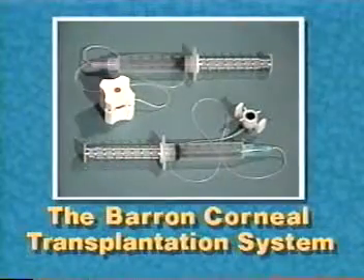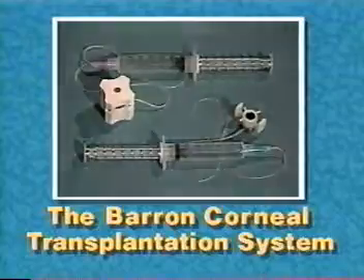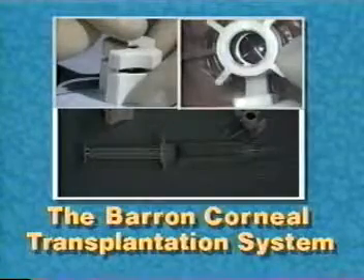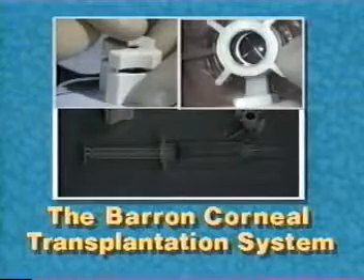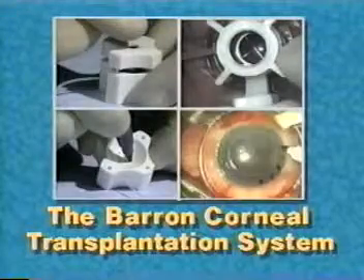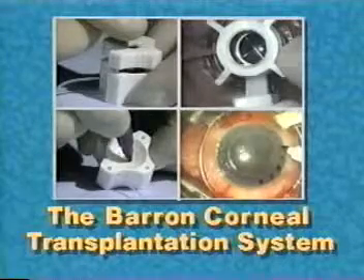The Barron Transplantation System is the only system that stabilizes both the donor and recipient corneas as they are cut, contains crosshairs for centration, and marks the donor and recipient corneas for even tissue distribution and suture placement.